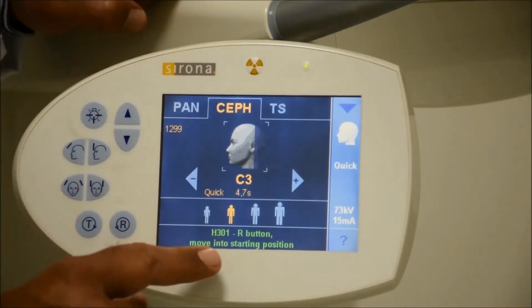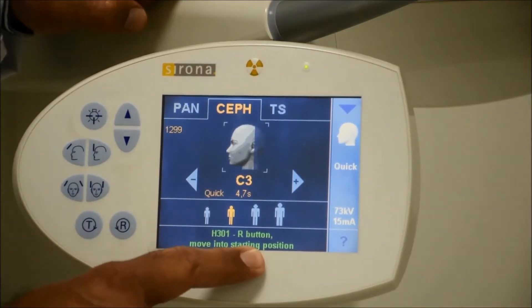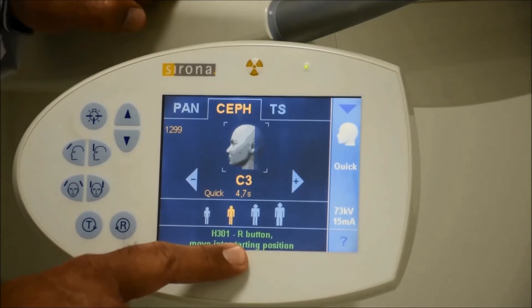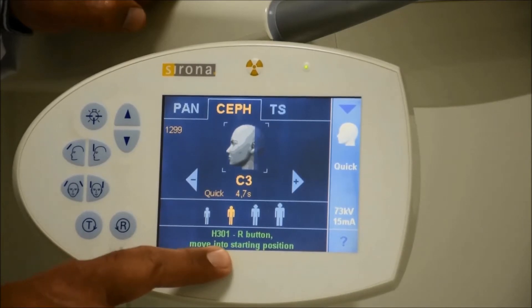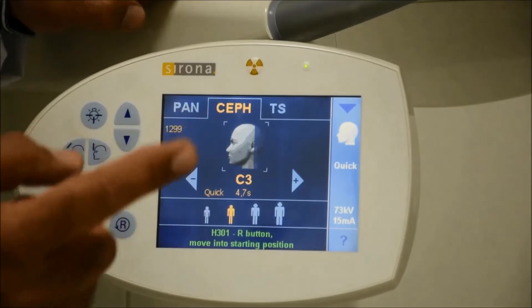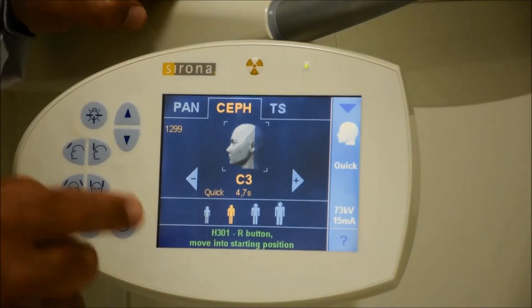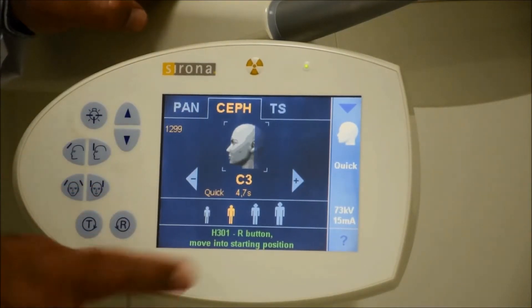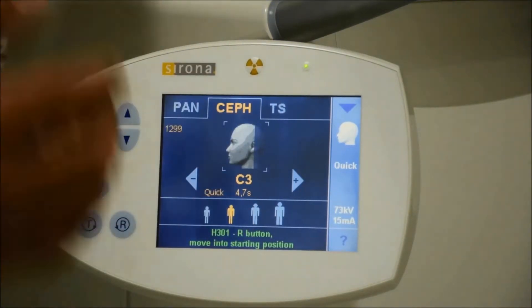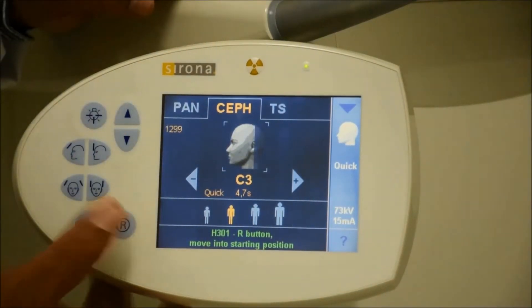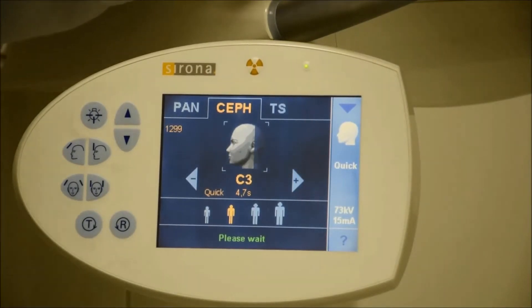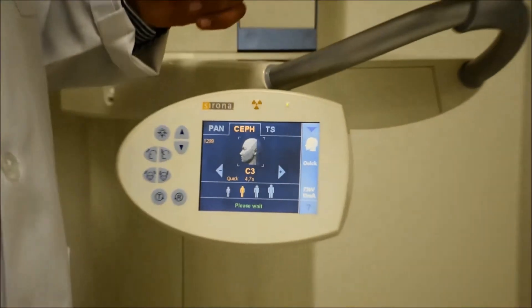After you choose the lateral ceph, a help message will appear saying to click the R button to move into the starting position. You need to click the R button several times because there are many steps requiring resetting of the machine. The first step is that the machine will start moving.